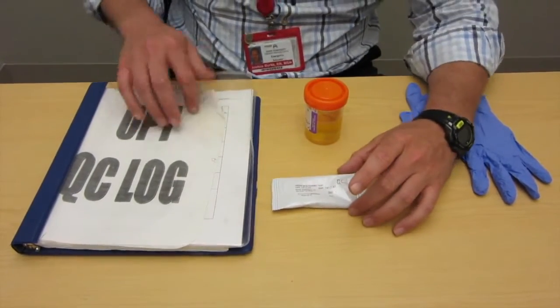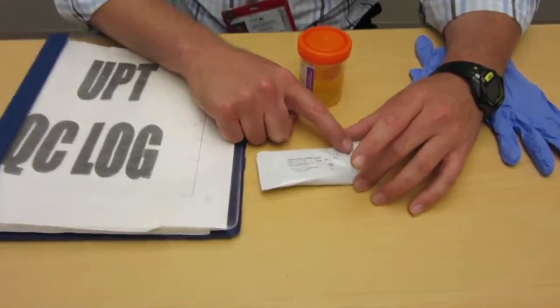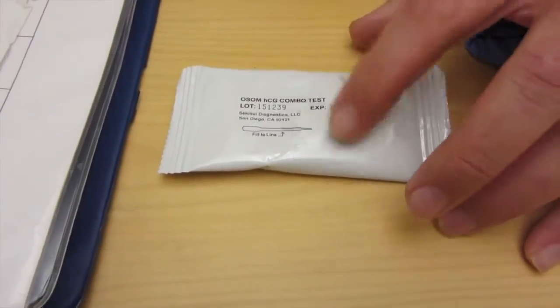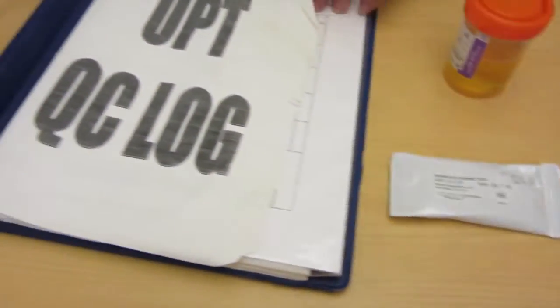Here's the actual test itself. I want to introduce you first of all to QCDN. You see this lot number here 151239. What we're supposed to do is we're always supposed to take a look at that lot and then find that lot over here in the binder.